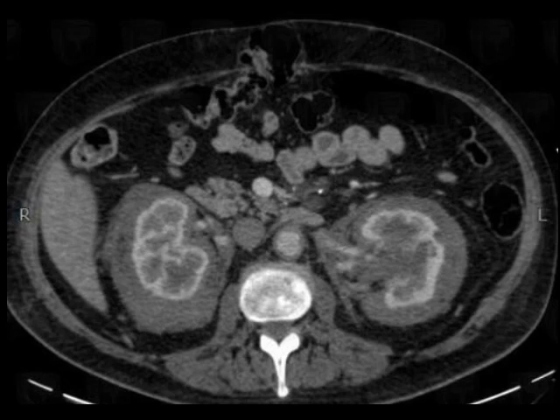Pattern 4 is perirenal disease. Now, usually when lymphoma gets into the perirenal space, it's either because it's extended outwards from renal lymphoma, or it's extended inwards from retroperitoneal lymphoma. Rarely you can have this pattern, pattern 4, which is isolated perirenal disease. This is lymphoma that surrounds the kidney within the perirenal space but doesn't cause any compression of the kidney. It's a rare pattern, but I've mentioned it because it's virtually pathognomonic of lymphoma and will therefore be an excellent exam question.